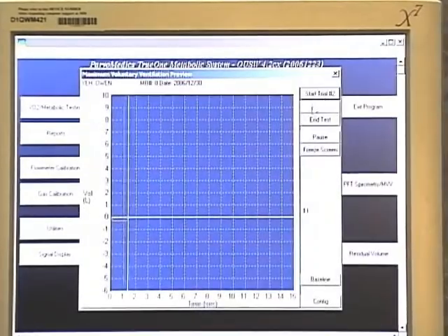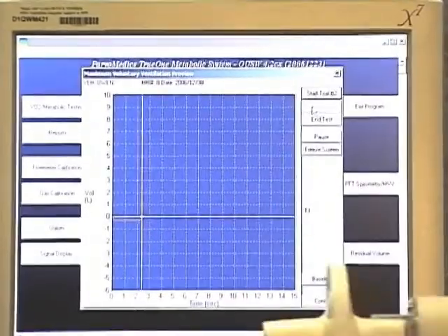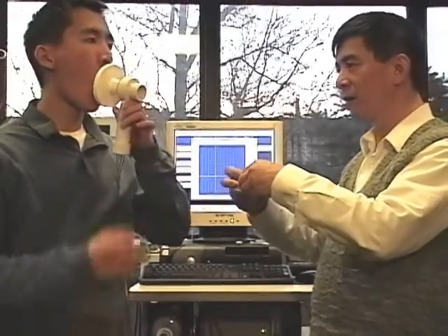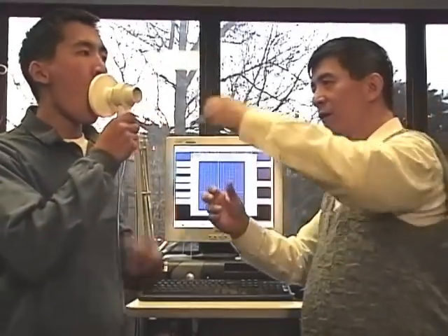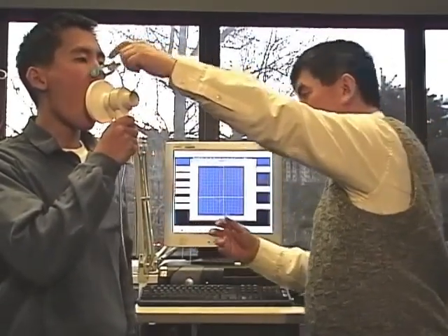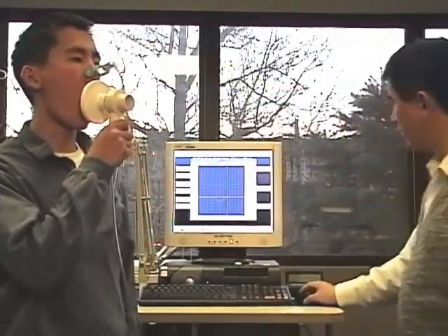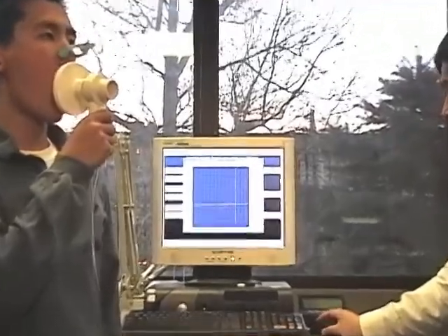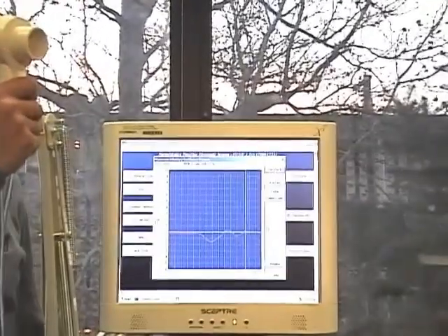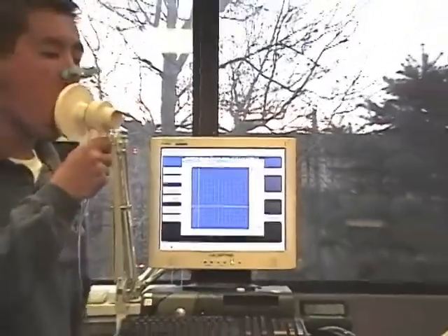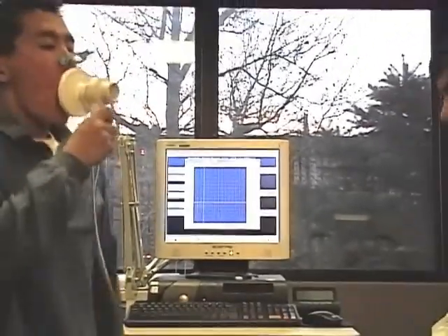Now we are ready to start the next MVV test. Ready? Go! Faster, deeper, faster, deeper, deeper, deeper.